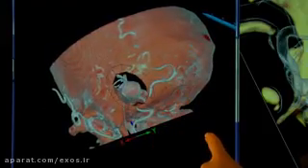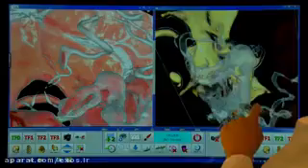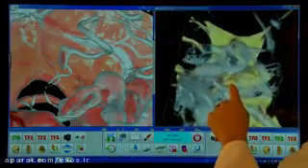And here we have a vertebrobasilar junction aneurysm, and I'm looking down the surgical corridor which we placed, and you can see the vertebral aneurysm here, and I can rotate this to see the other side of the anatomy. And here we have clear tissue segmentation for the vessels, which gives us a very good look at the origin vessels and the neck of the aneurysm, which you can see here.